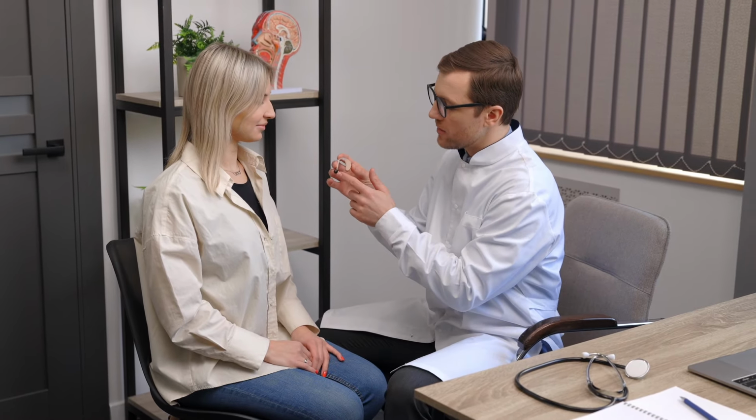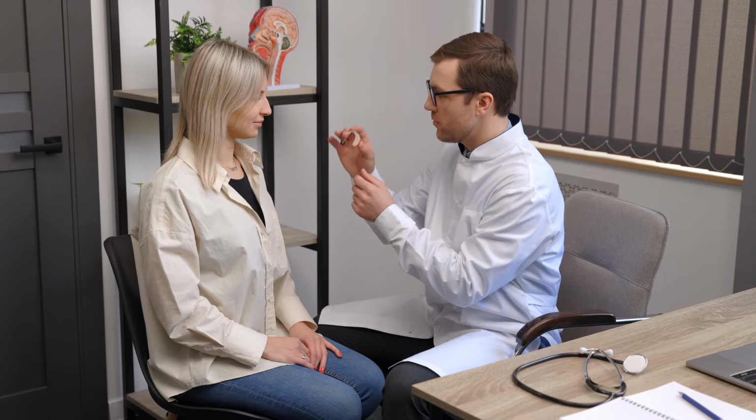Now, after using the adjusted AirPods, here are my thoughts on how the overall process works. So the first thing is, this is definitely meant for mild to moderate hearing loss. If you happen to have severe hearing loss, this probably isn't the product for you. Second, it may take a little bit of time to get used to the adjusted results. Apple always gives you the option to personalize your audio results and the way you hear things. So if you're not hearing things the way you like, you do have the option to adjust it further.